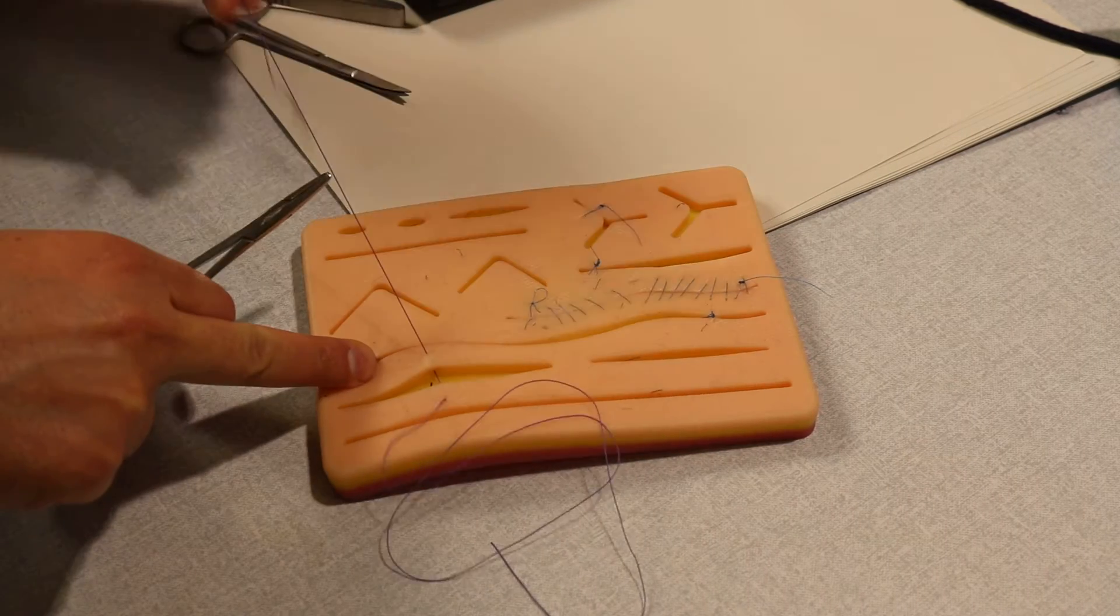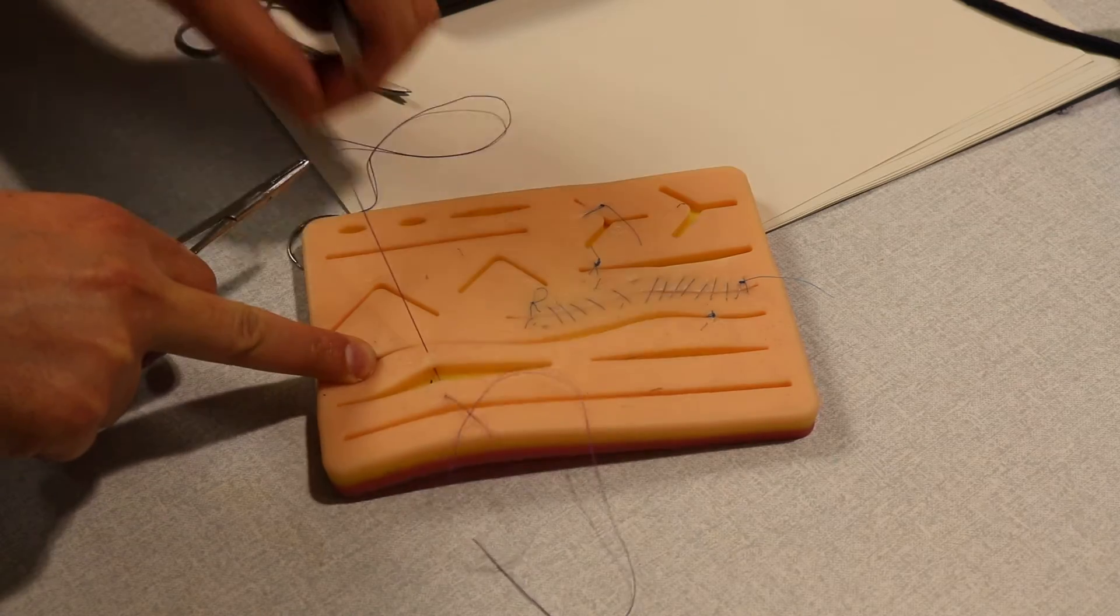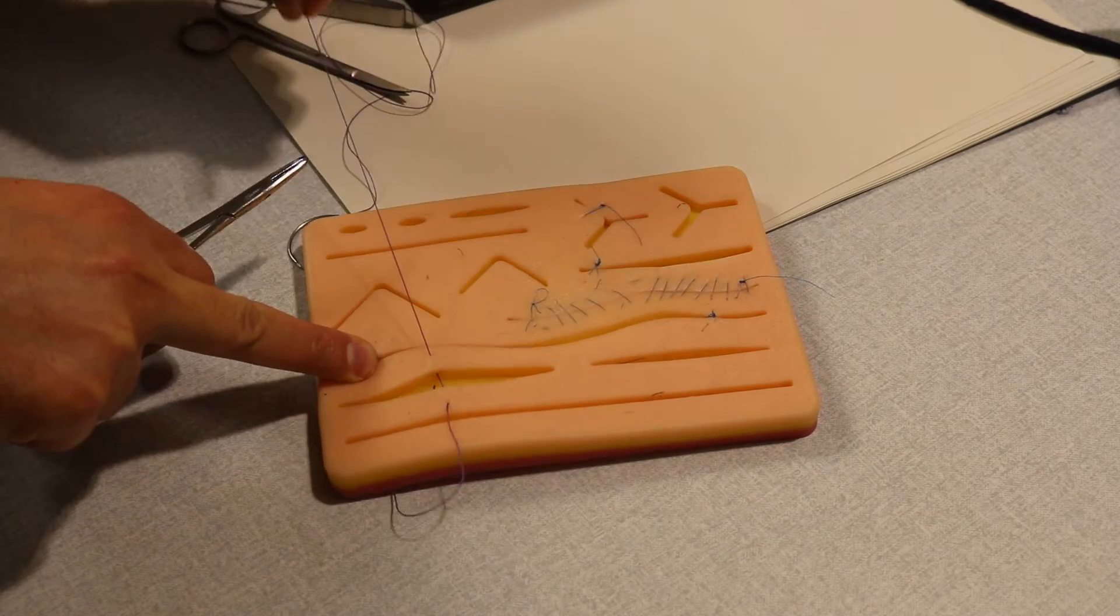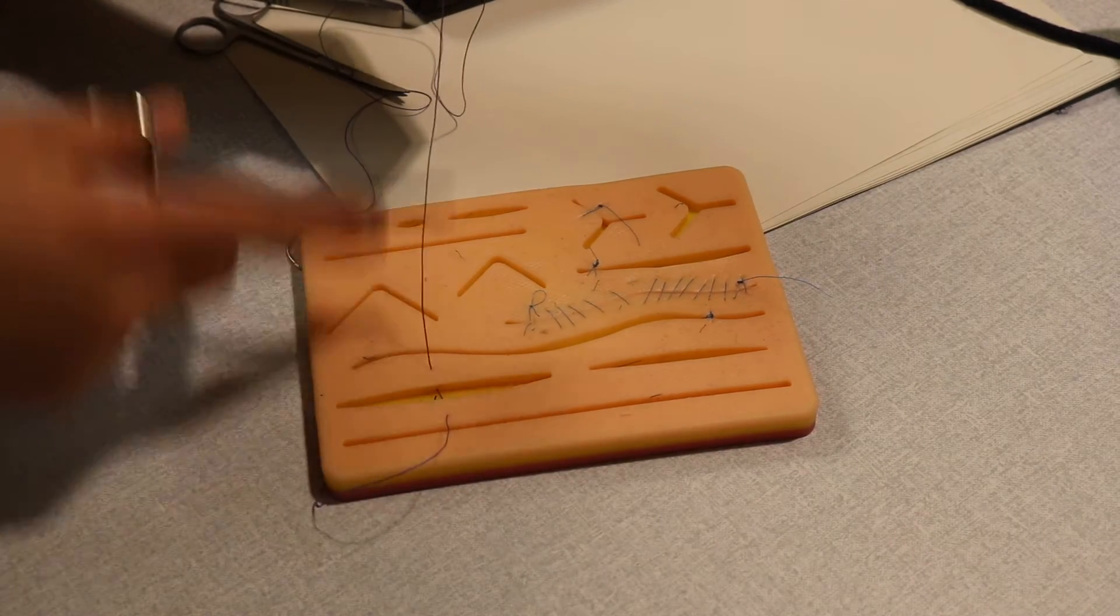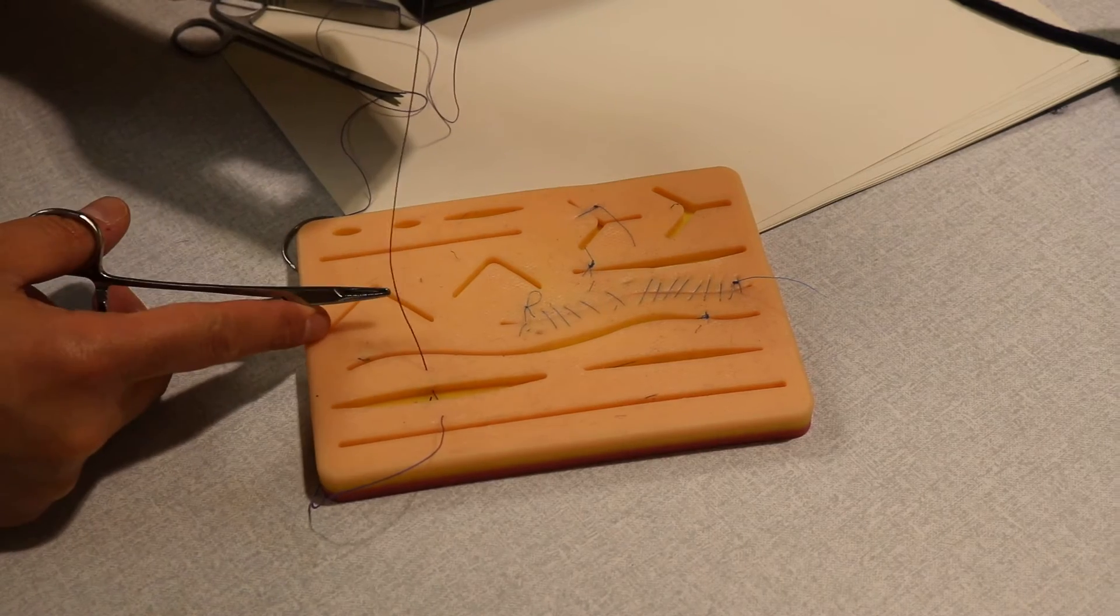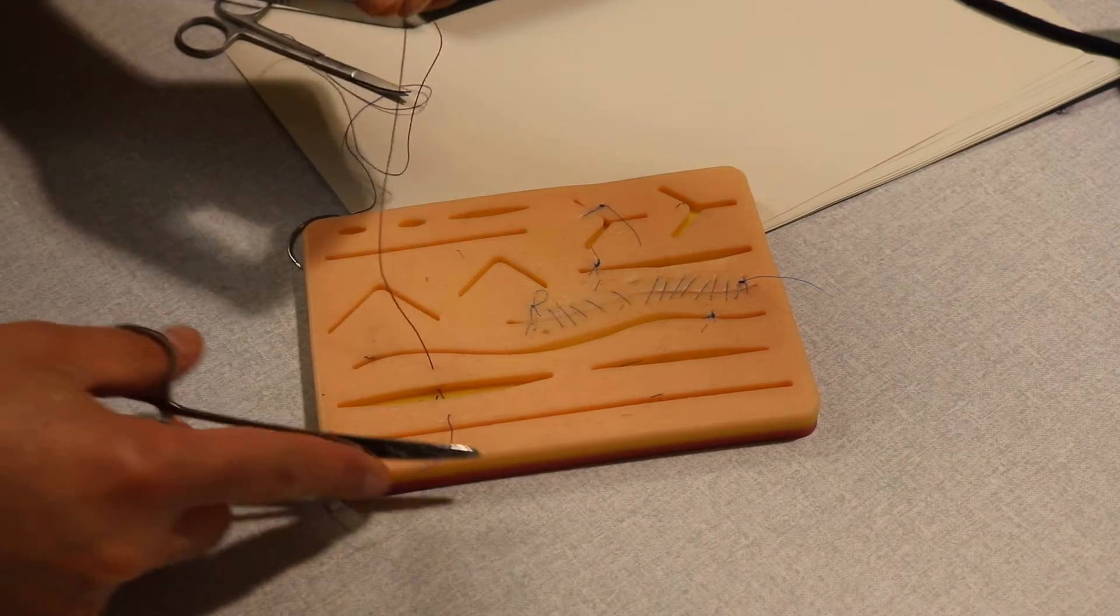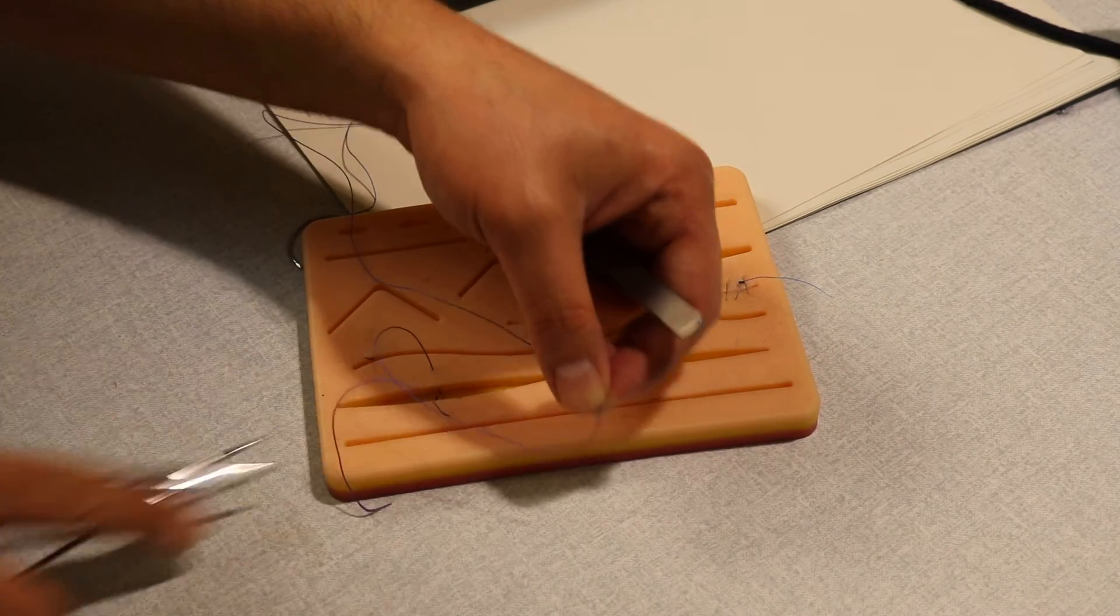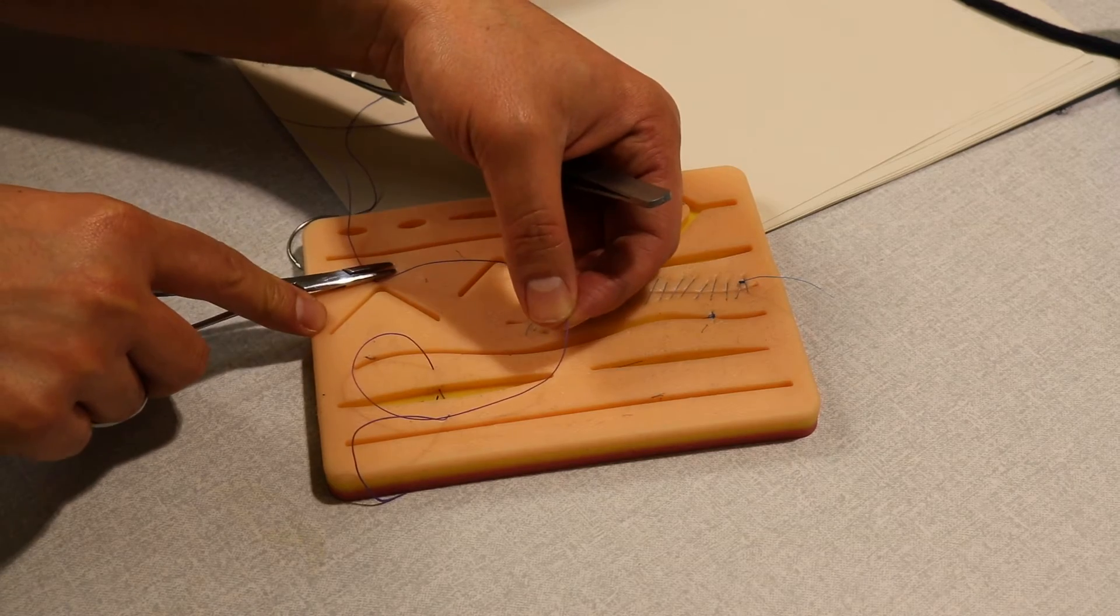So I need to pull that and create what we call a short limb and long limb attached to the needle. If I tie these together and cut, I can use that again.